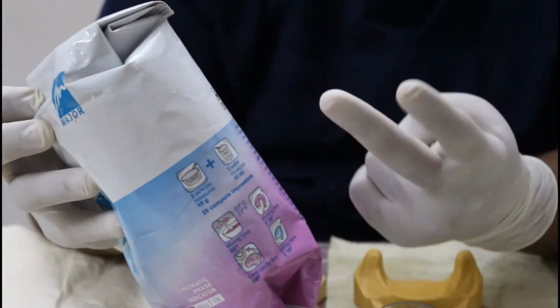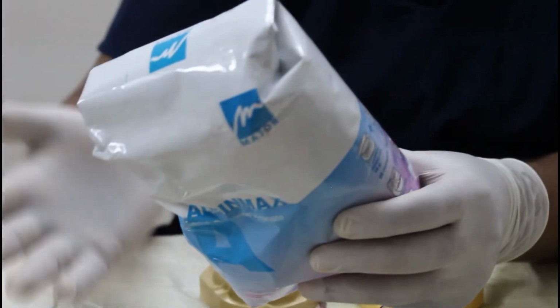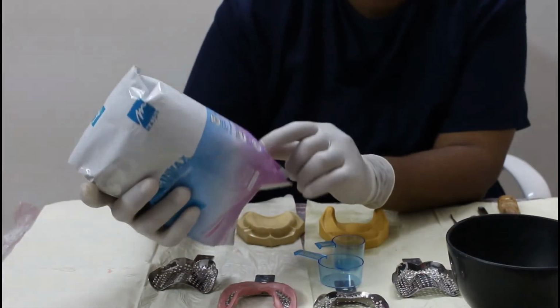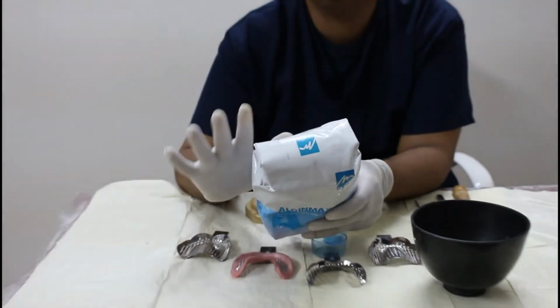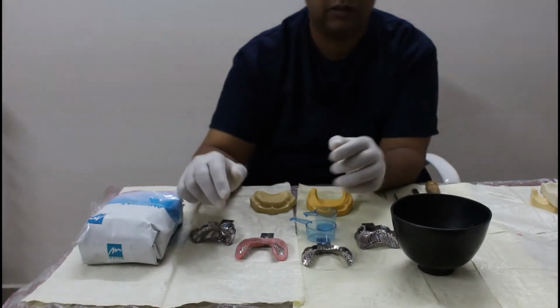Imagine, just 2 minutes we have for material to mix and load in the tray and put in the patient's mouth. And then setting time is just 2 minutes. So from this time of mixing till the setting we have only 4 minutes. So everything has to be done fast.